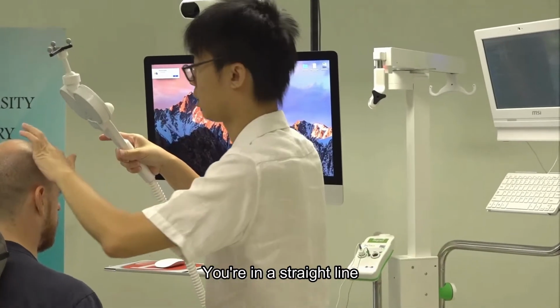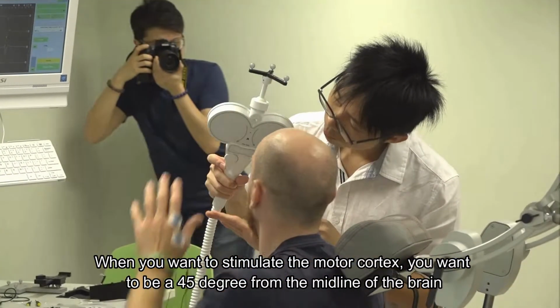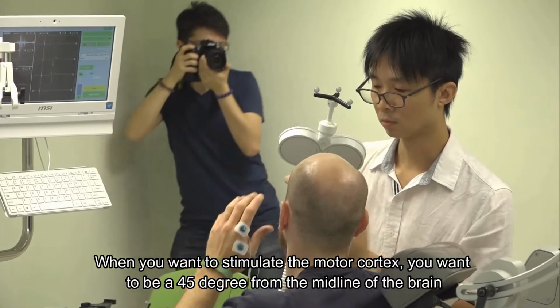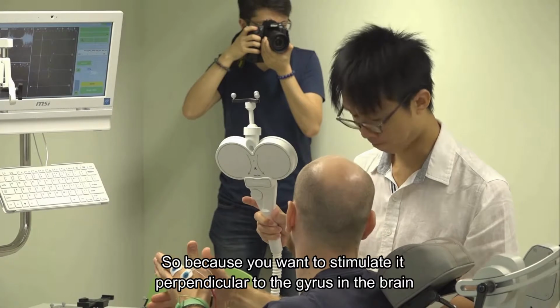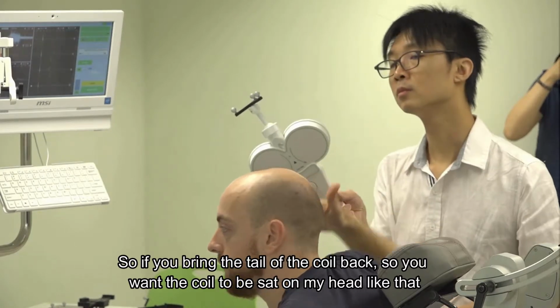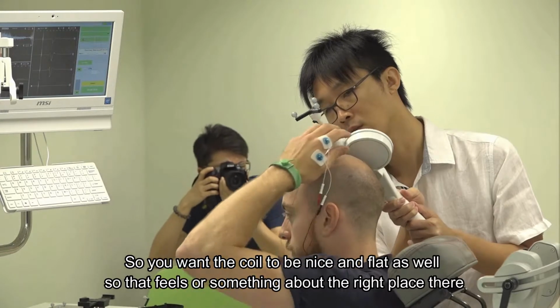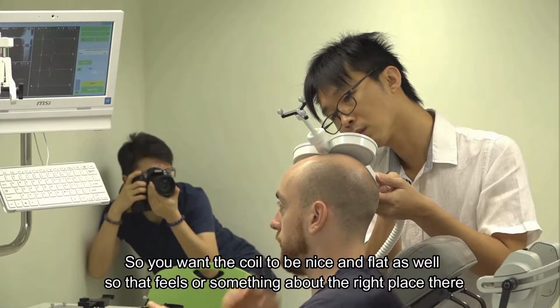Yeah, so you're in a straight line. So when you want to stimulate the motor cortex, you want to be at 45 degrees from the midline of the brain, because you want to stimulate perpendicular to the gyrus in the brain. So if you bring the tail of the coil back, you want the coil to be sat on my head like that. That's it, yeah. You want the coil to be nice and flat as well. So that feels as though it's in about the right place there.